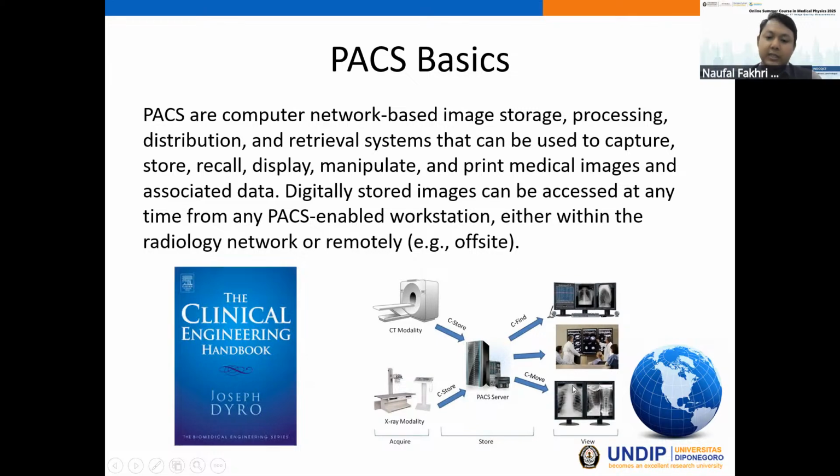So basically, PACS is a server, an image server, mainly for storing image data. It is very commonly used in hospitals which serve radiological facilities. So this is the diagram, the typical PACS workflow.